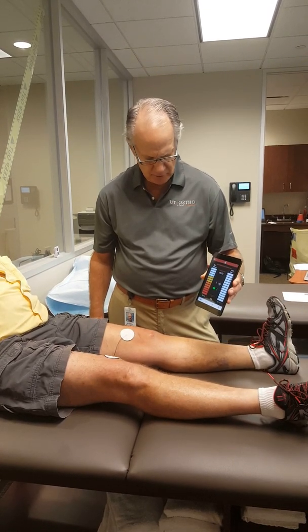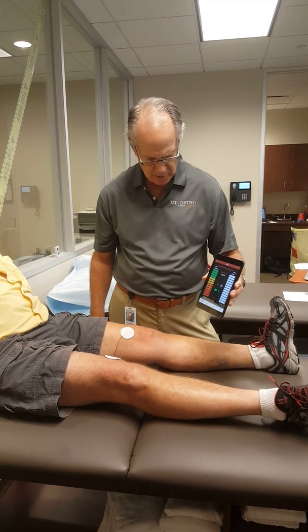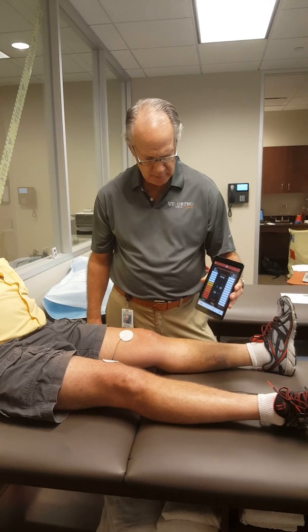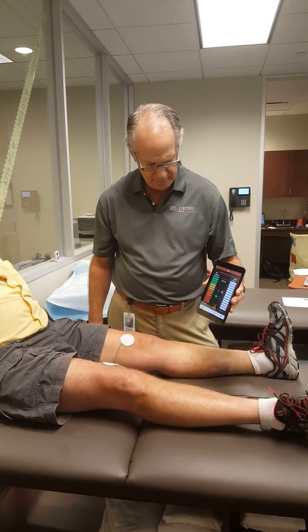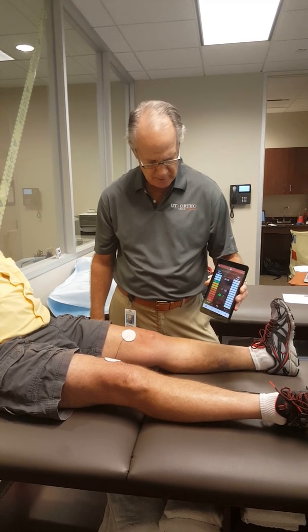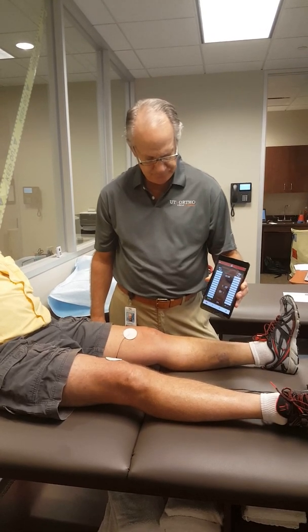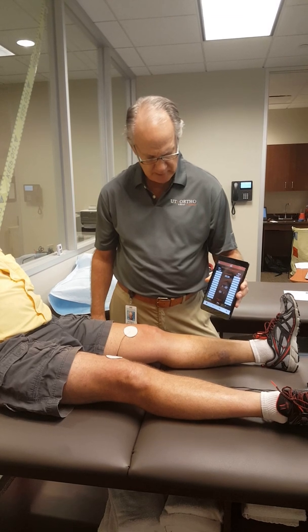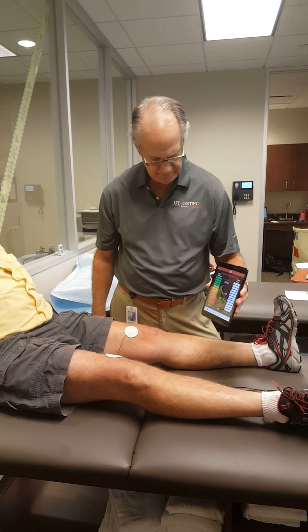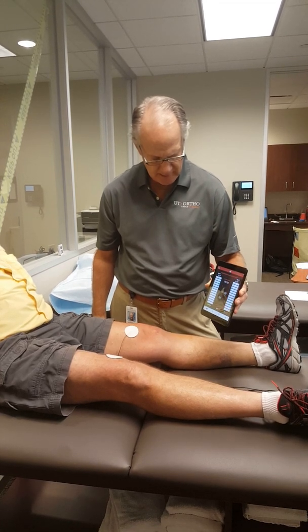Tighten up. Squeeze as hard as you can. Keep squeezing — hard, hard, hard. Rest. Just like a three-second trial, or maybe five seconds. Tighten up again — pull hard, hard, hard, and relax. One more time when it lights up — tighten up, squeeze as hard as you can. We're getting 13, 14, 15, 100 there. Relax.